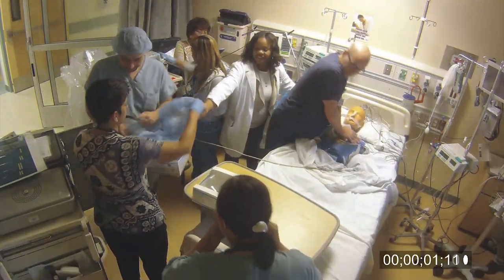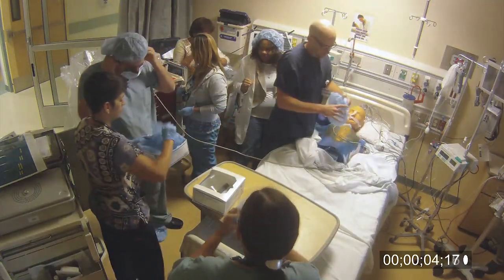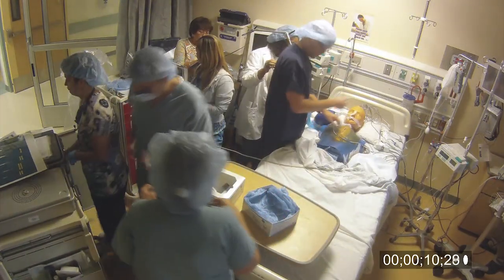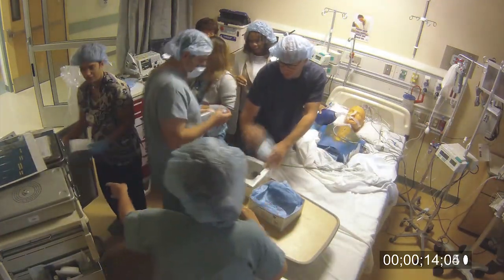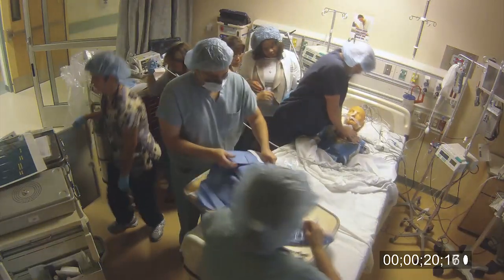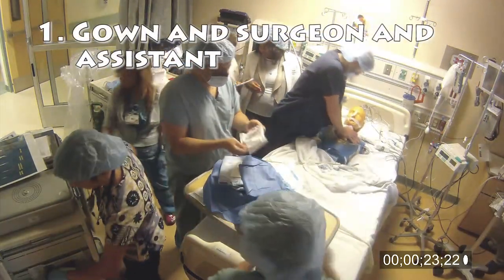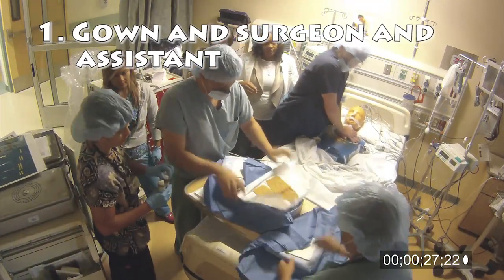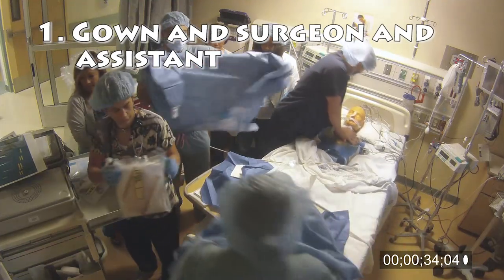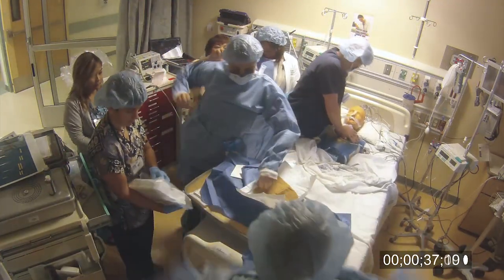The surgeon comes down and announces it's time to open the chest. We've already got the cart there. First, everyone puts on a gown or at minimum a hat and mask. We gown and glove the surgeon and his assistant. Someone needs to remove the dressings before prepping. The patient should be bagged at 100% FiO2. One nurse should be giving emergency medications. The drips should be turned off unless the surgeon wants them on. Make sure you know where the pacing box is and have cables hooked up to the wires and pacing box. Put the external defibrillator pads on before the sterile field is set up if they are not already on, preferably using the external defibrillator pads with the long cord.